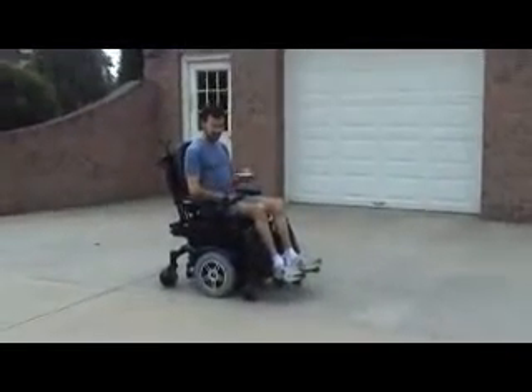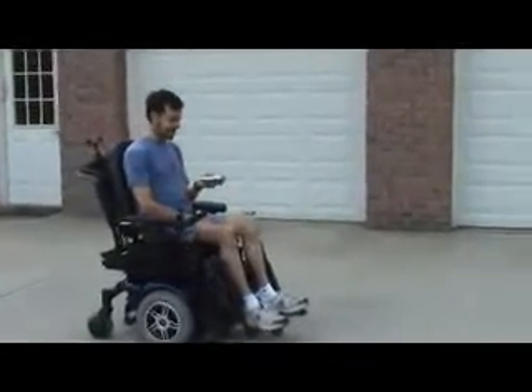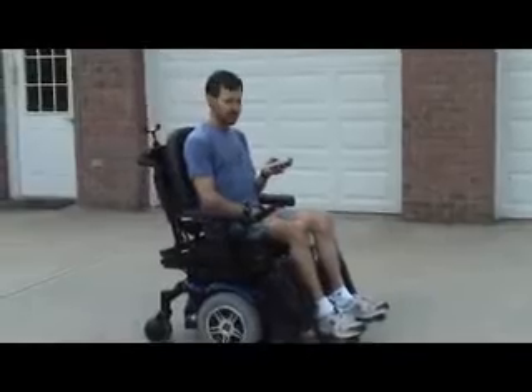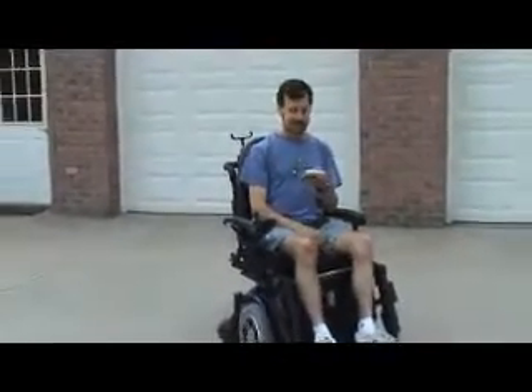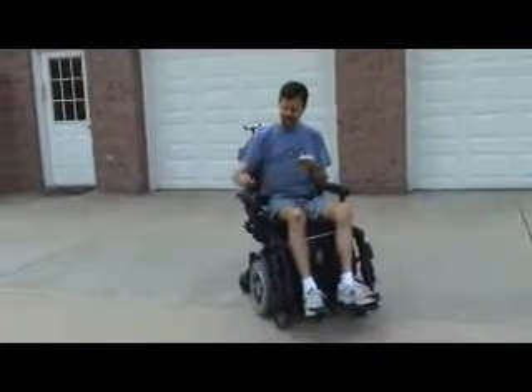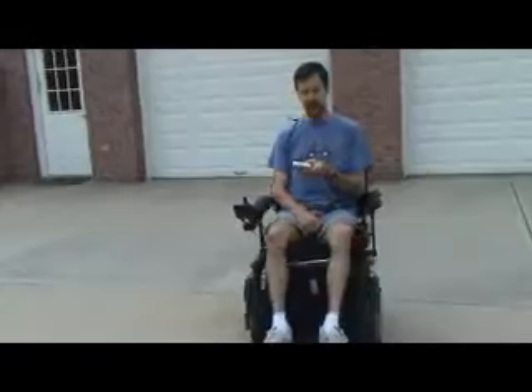My handy dandy keypad — press the button, and off we go. I'm going to hit the button to turn, turning towards the left. Speed her up a little bit, go slow to make sure we don't get into trouble.